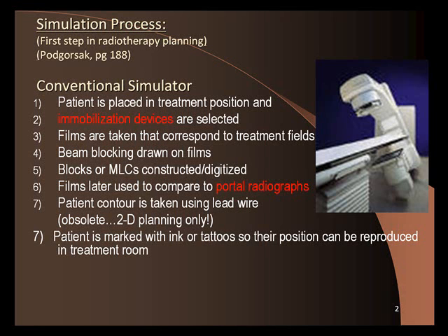This is old. This is really old. This is before CT scanners were around, and this is when I started in this field. This is what we did. The patient would lie down on the table, and the dosimetrist or the physicist would come. Have you guys seen solder wire? Yeah. It's kind of soft wire, right?